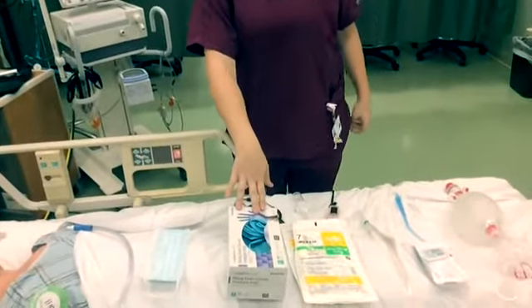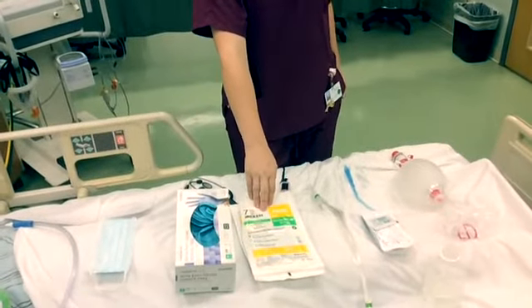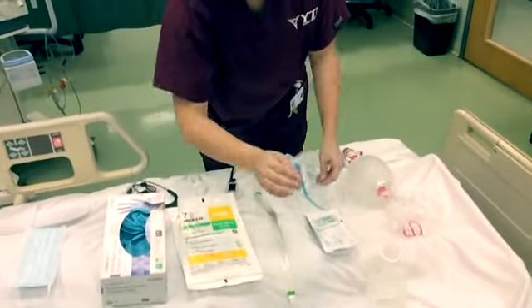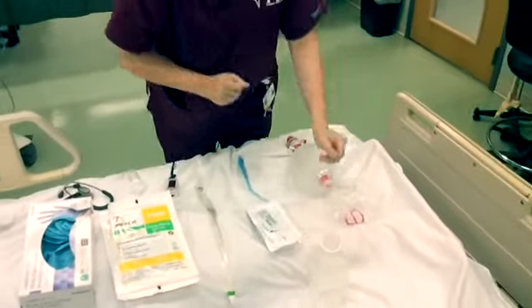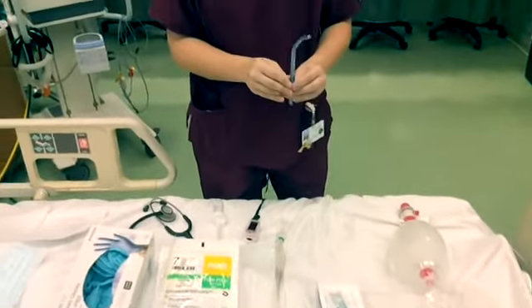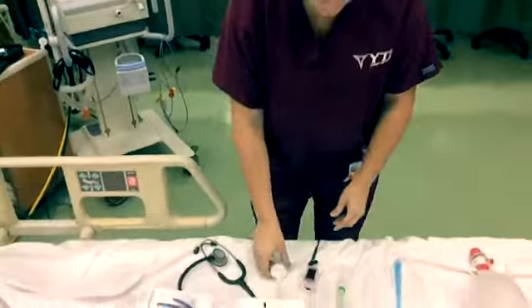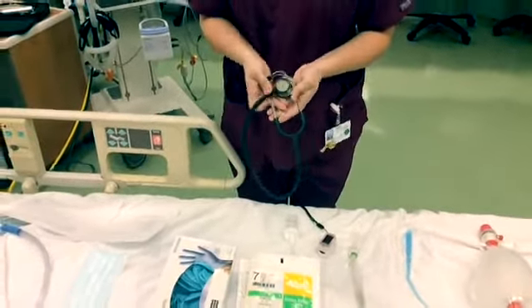We have clean gloves for closed suctioning and sterile gloves for open suctioning and for nasotracheal. We have our inline catheter suction here. We have our nasotracheal catheter with our lubrication, sterile water, an ambu bag for emergencies, a yankauer for open suctioning, a sputum collection container, a pulse ox, and a stethoscope.